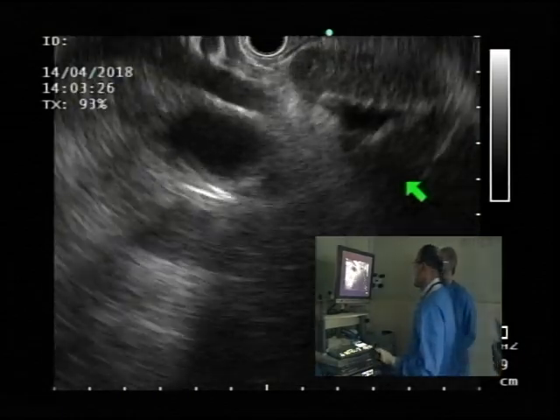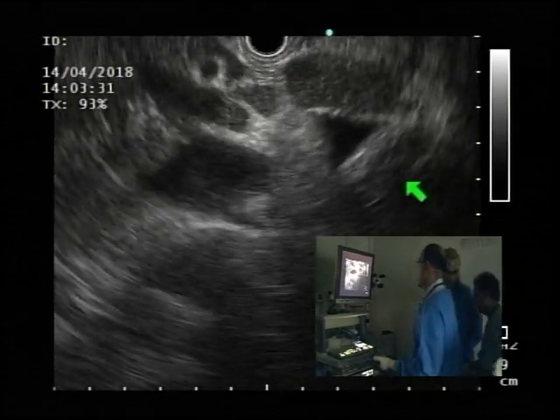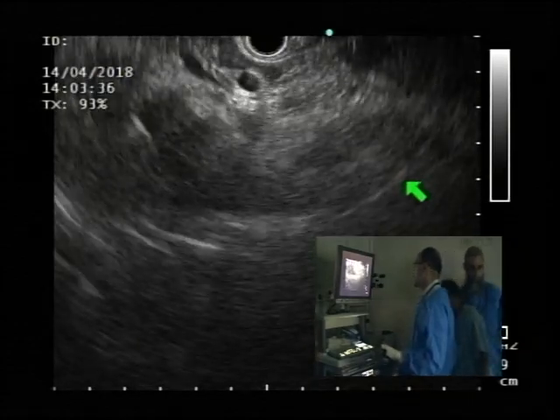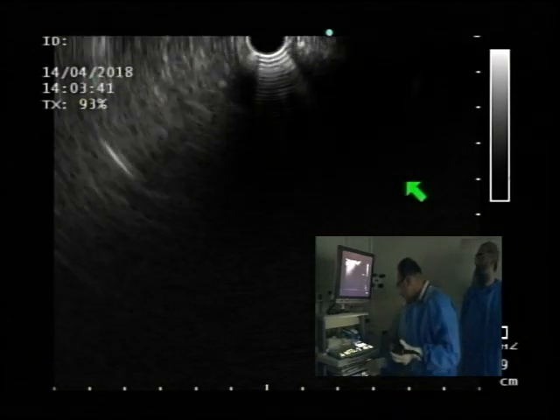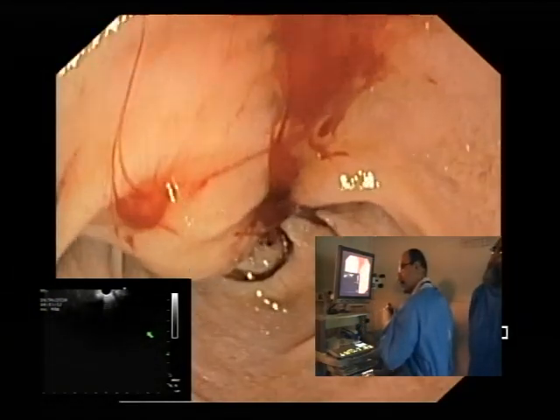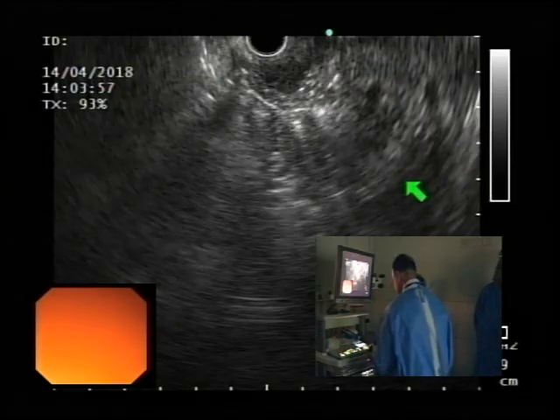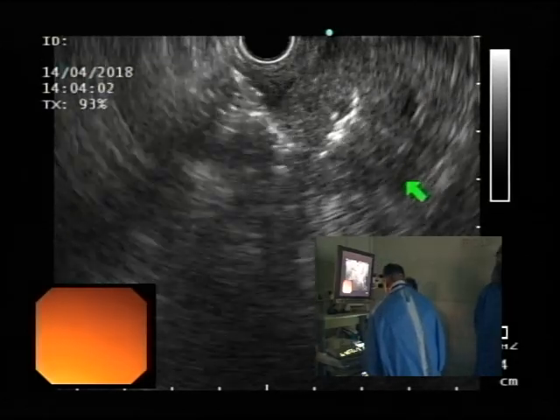This is concerning. This lymph node. Sure. Okay. This is a porta hepatis node, which could be either or, benign or malignant. Endoscopically it's secondary. And ultrasound could be. Thank you.